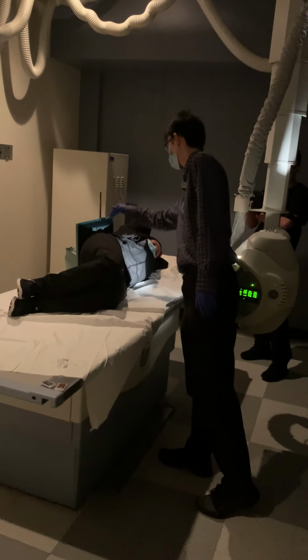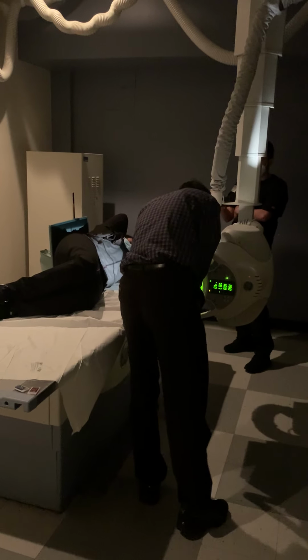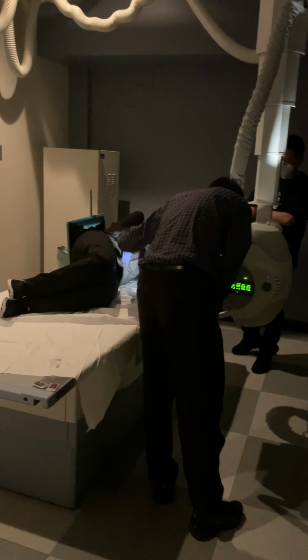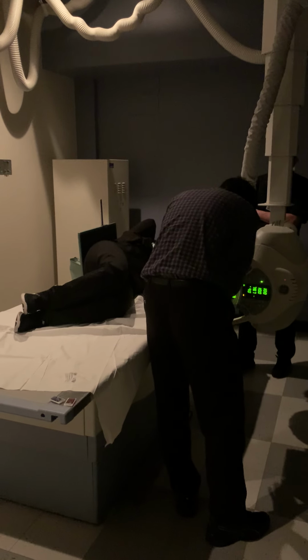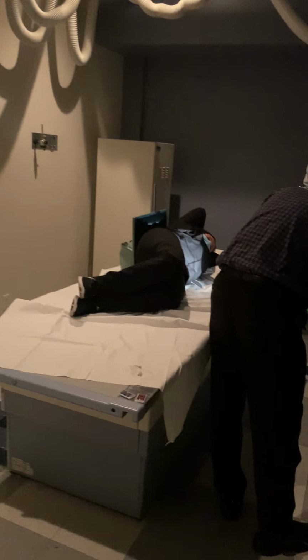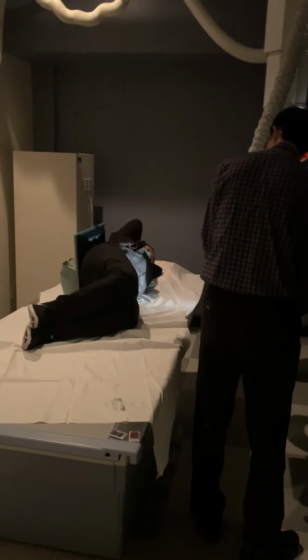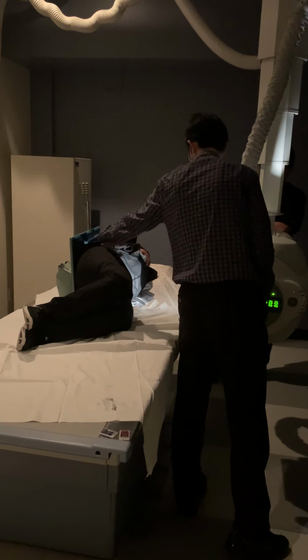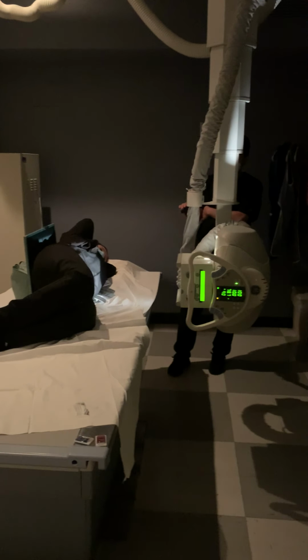We don't care about the hips, we don't care about the shoulders. We do want to make sure that we have light on the board and then we have light here on the table. So let me make sure that we do have light on the table. There it is. Okay. Light on the board, light on the table.